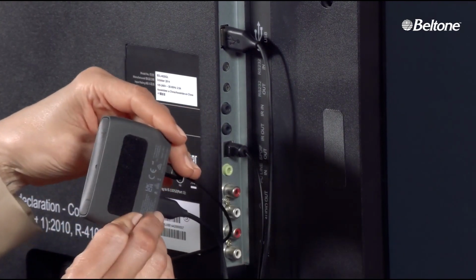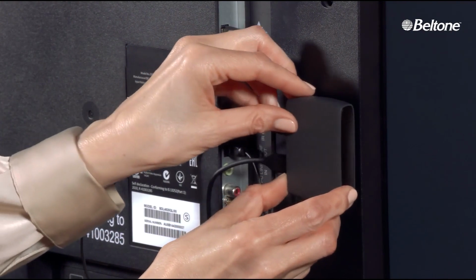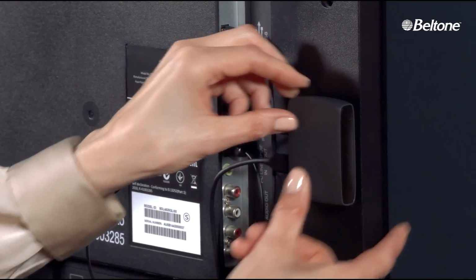The device is then secured to the TV, matching up the two Velcro strips and positioned with its wires facing the TV outlets and wires.